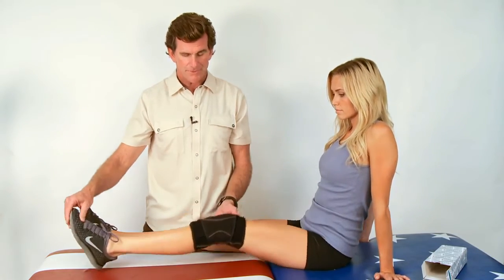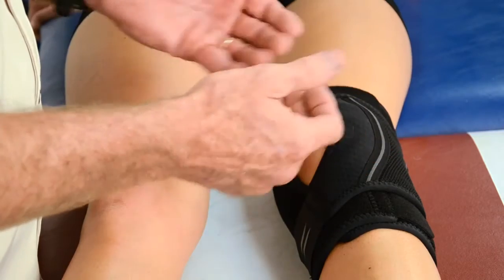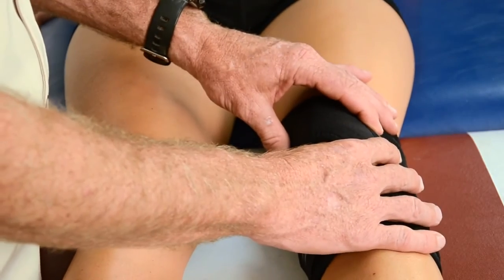I often use the example, if I could just hold your patella in the right spot, then you could be pain-free. The Shields 2 patellofemoral brace does that with the application of a properly applied buttress.